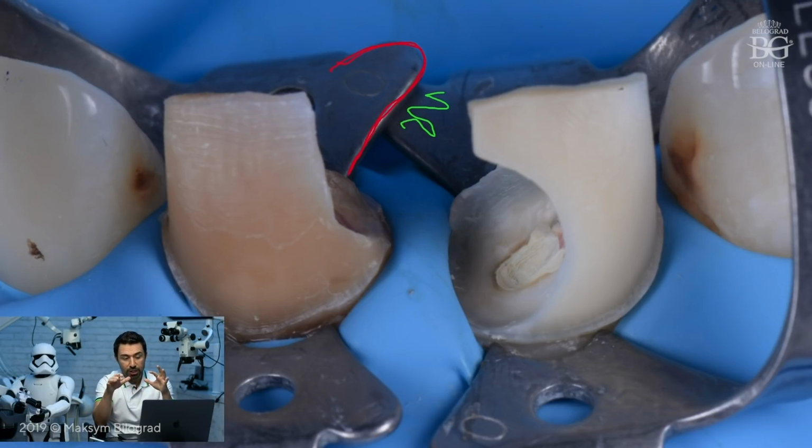It was found accidentally. It was not like I knew exactly what to do. I tried, I experimented. Now I would know what to do if I needed to stabilize a clamp. I can stabilize the clamp with the adjacent clamp. In that case it was found accidentally, but now I'm sharing that trick with you. And if you have something similar, now you will be able to understand how you can secure a clamp by an adjacent clamp.